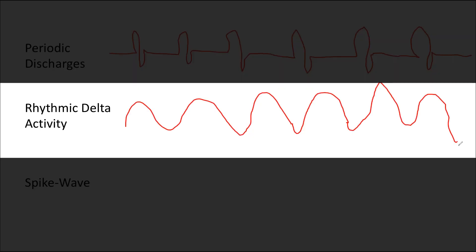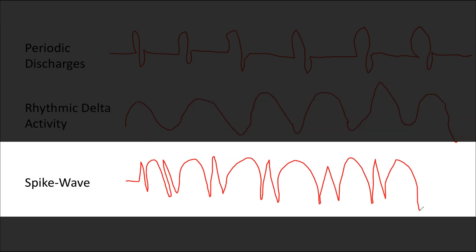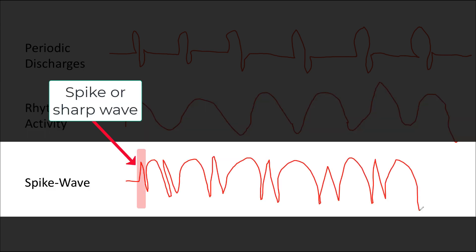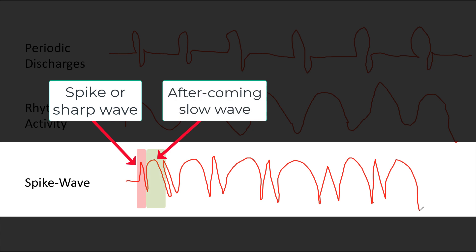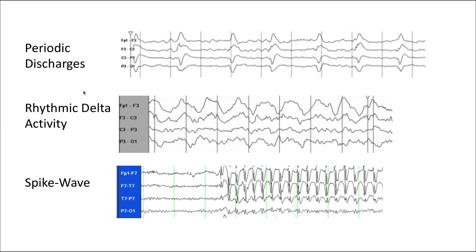Rhythmic delta activity consists of activity in which there is no inter-discharge interval. Here is an example of a very sinusoidal rhythmic delta activity. Spike or sharp wave activity has a spike or a sharp wave that precedes or is associated with each waveform that follows it. Again, there is no inter-discharge interval. We can look at real-life examples of periodic discharges, rhythmic delta activity, and spike wave activity to illustrate the difference.